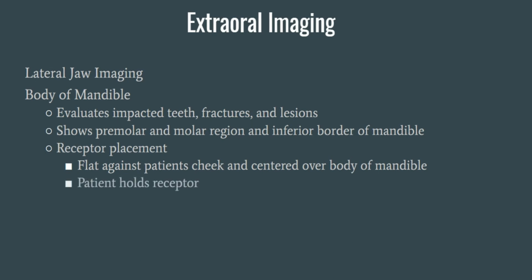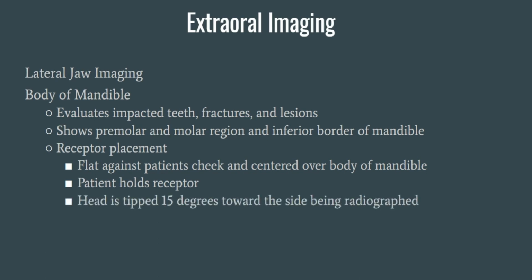The patient will hold the receptor in place. And then the head is tipped at 15 degrees towards the side being radiographed.